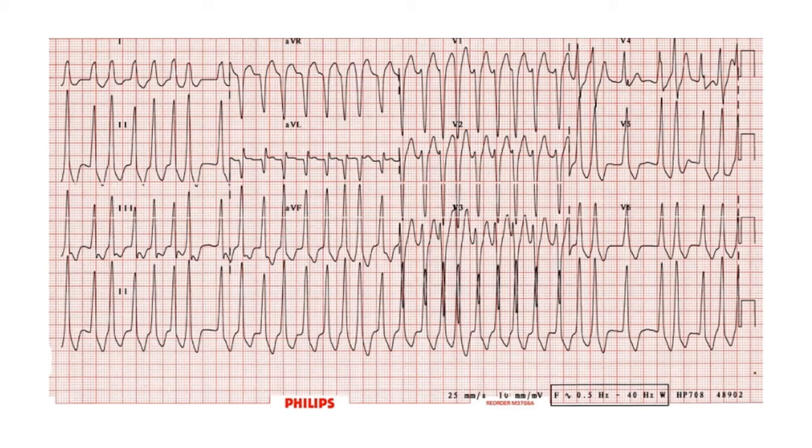Okay, so here is another tachycardia. What do we think about this? Pretty similar to the prior one, right? We've got a wide complex tachycardia. Is it regular or irregular? It's irregular. So let's avoid giving nodal blockers. Your treatment is either going to be procainamide or cardioversion if the patient is unstable. Okay.